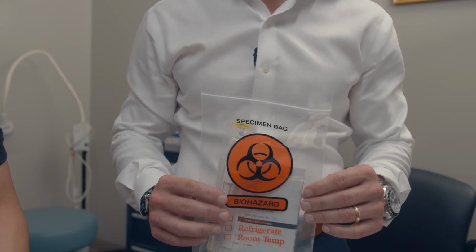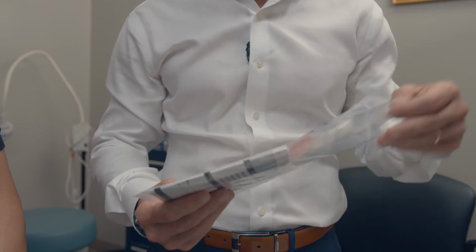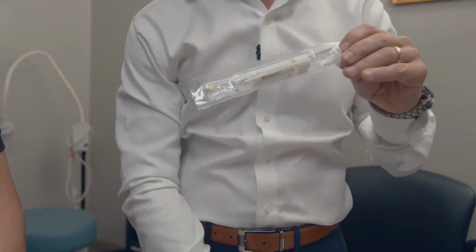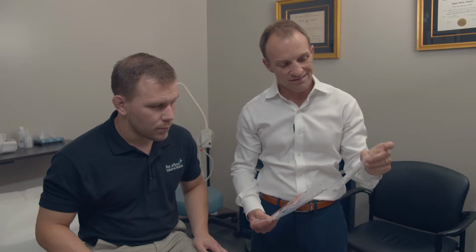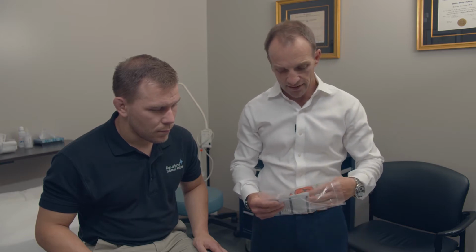You're going to receive in your test kit a specimen bag. Within that specimen bag, there's two important parts of equipment. One is the collection kit itself. It is sealed. You're going to receive two of them in case you make a mistake. Simple as that. Second thing is documentation paperwork, and this is going to go to the lab.